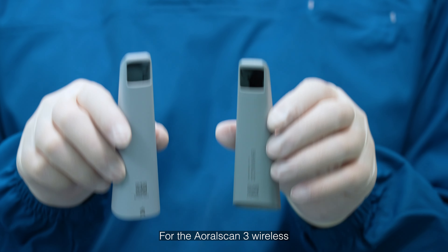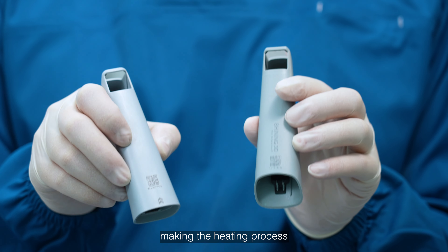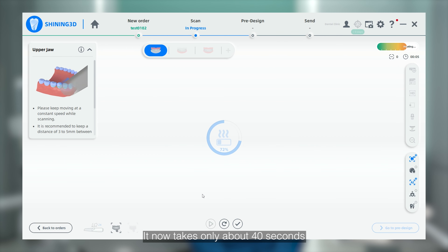For the AuraScan3 Wireless, we've improved the design of the scanner tips, making the heating process much faster than the AuraScan3. It now takes only about 40 seconds for the entire heating process.